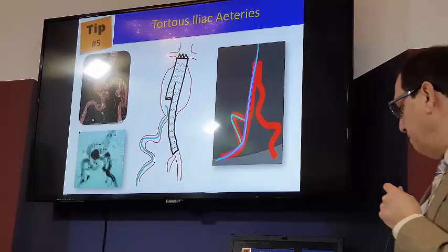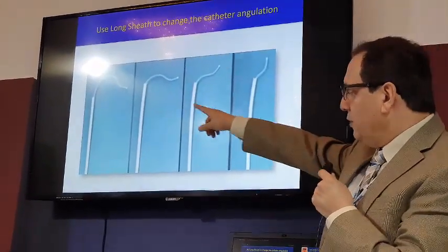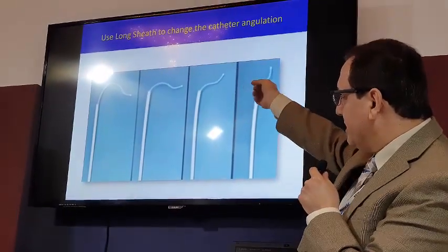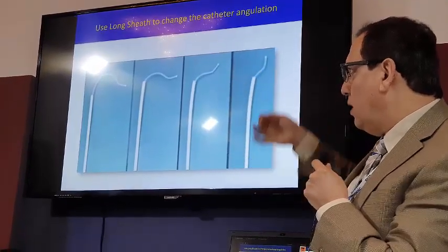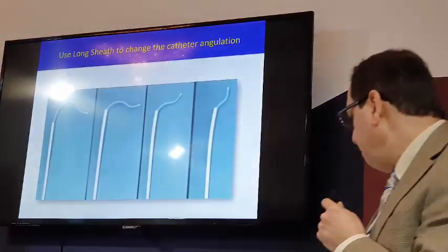the contralateral limb. The other thing is that if you have a long sheath and you have a catheter inside, you can change the angulation of the catheters by just putting the catheter inside the long sheath, and this way you can change the angulation in the way you want, to be much easier for you to cannulate the contralateral limb.